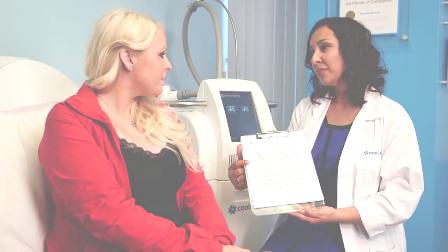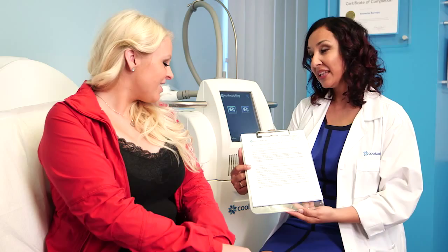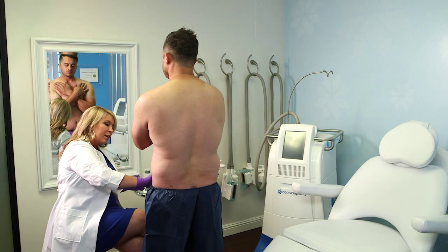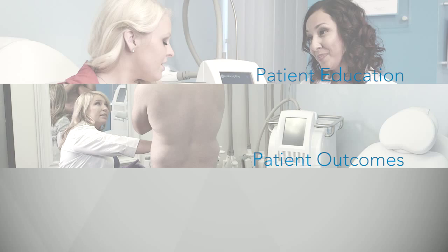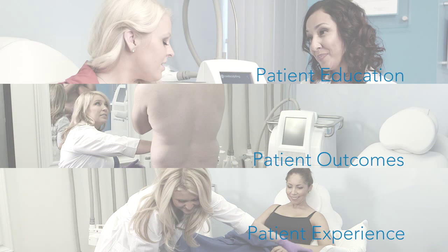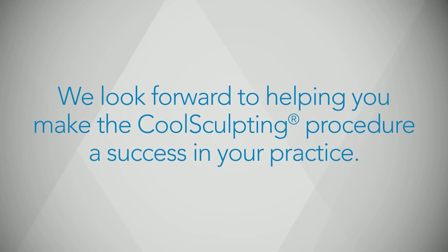To make the CoolSculpting procedure successful in your practice, properly educate patients on what they can expect during and after treatment. Deliver transformational results by performing a 360-degree assessment and developing a customized treatment plan. Provide the patient with a positive experience by creating a relaxed and welcoming environment. Thank you for partnering with us — we look forward to helping you make the CoolSculpting procedure a success in your practice.